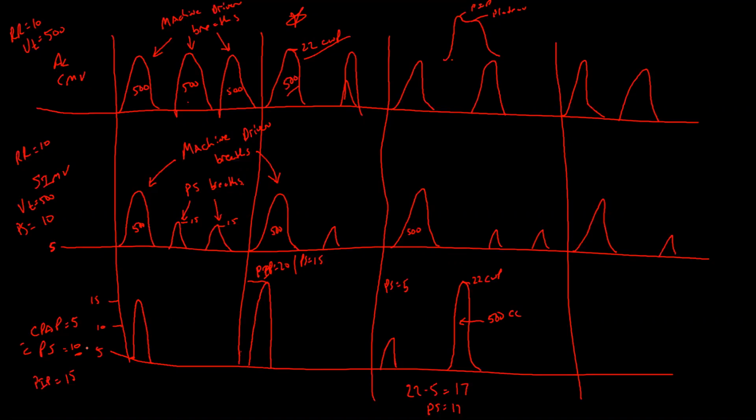And pressure support is ventilation. Well, pressure support helps us blow off CO2. Pressure support would be equal to adjusting the tidal volume, which, yes, does affect ventilation.